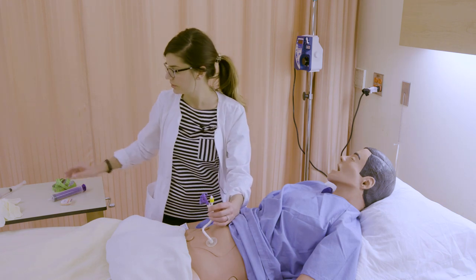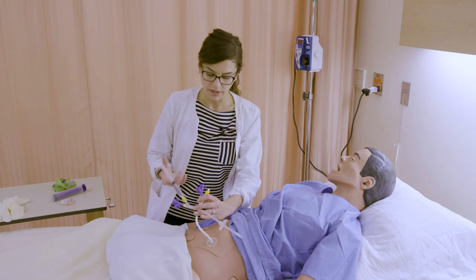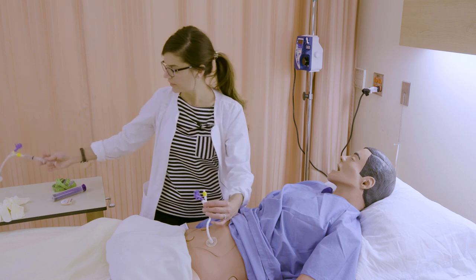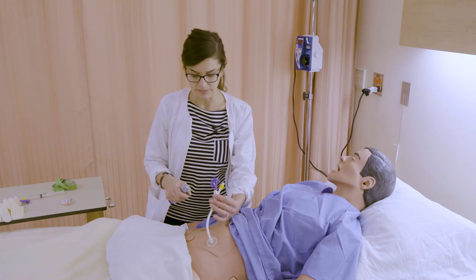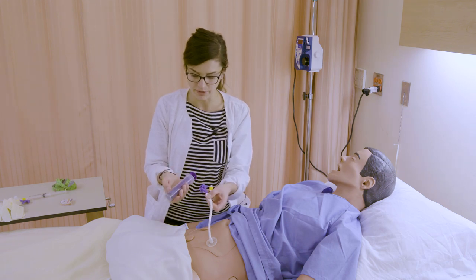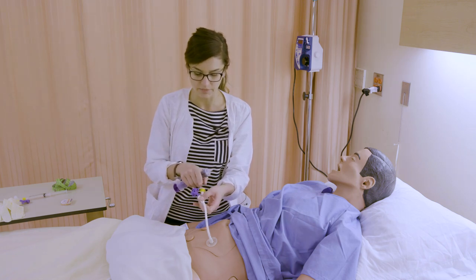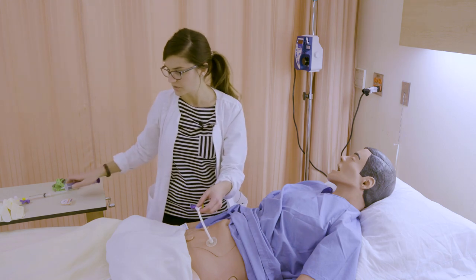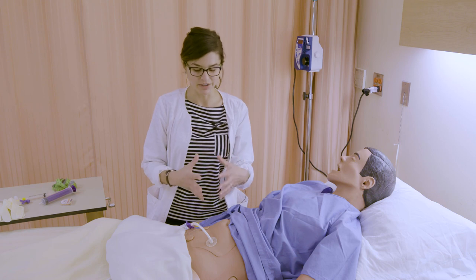An important point about the balloon gastrostomy tube is the balloon port. Make sure that when you're accessing the tube to give medications or feedings, you don't accidentally access the balloon port. They've tried to make this obvious by using NFit-type ends which are purple, matching our purple enteral syringes, so just be mindful not to put anything into or remove anything from that balloon port.